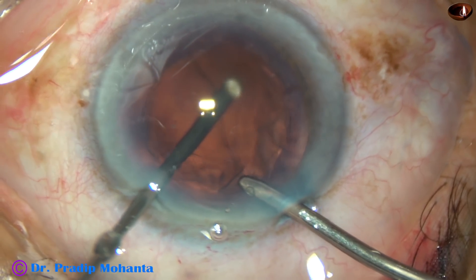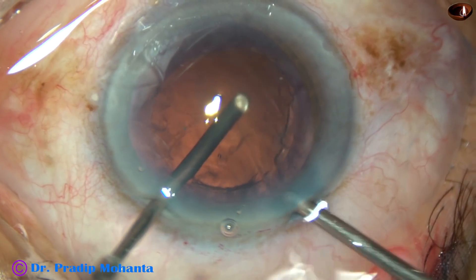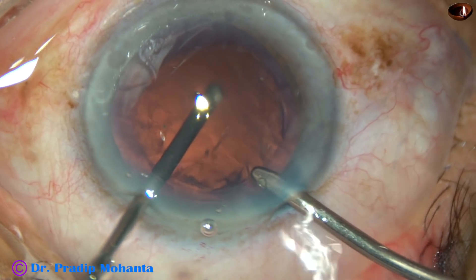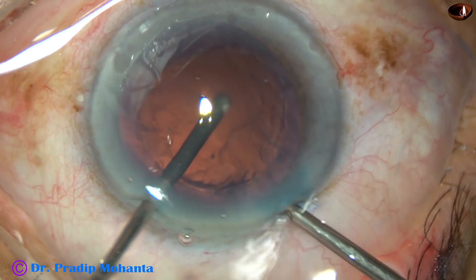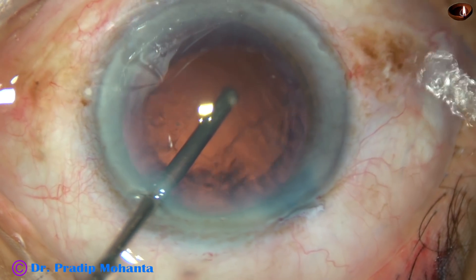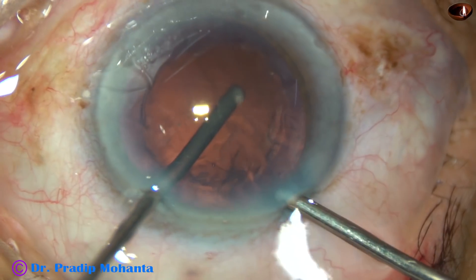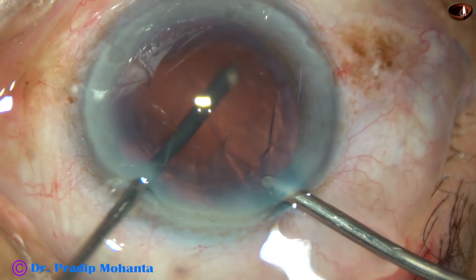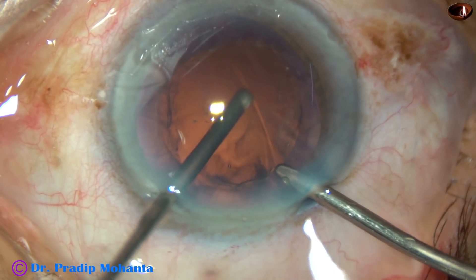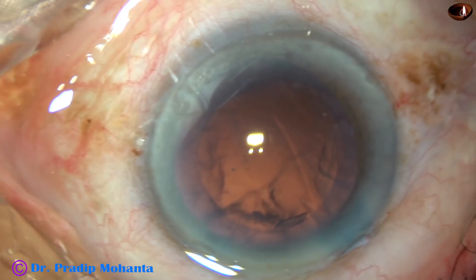So the first thing we should do is anterior vitrectomy. In this case, I have used intermittent irrigation to reduce hydration of the anterior vitreous initially. And now I am using irrigation almost continuously. I find that the vitreous has not been hydrated and has not prolapsed into the anterior chamber. This is a good way to prevent hydration of anterior vitreous. If the vitreous gets hydrated, it cannot go behind — it has to come into the anterior chamber.